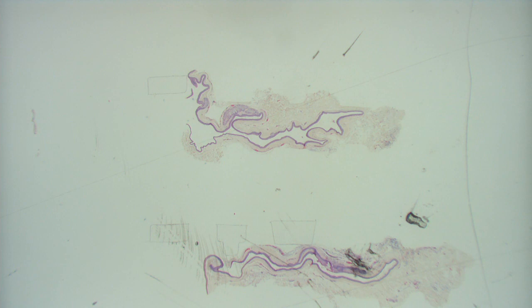All right, so what kind of biopsy are we looking at? A small shave, but there's no epidermis, is there? So there are kind of five types of biopsies, but the two most common are shave and punch, and then excision. Some people do incision, which is relatively uncommon. And if you're in the clinic and somebody's got a little knot on their scalp, you do a little nick over the top and press on it, and it pops out. What's that called? An extraction, or enucleation. So those are the main types of skin biopsies dermatologists do.